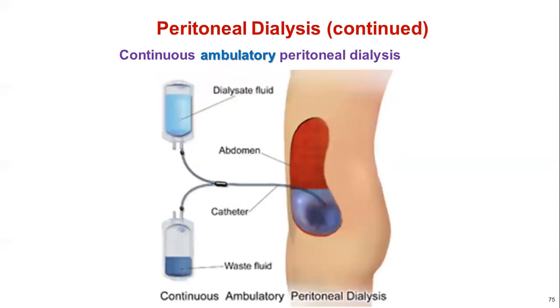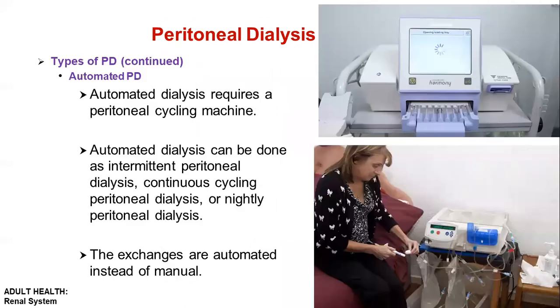So in this picture, I already explained, and here showing a portable peritoneal dialysis. Portable it is, and sometimes patients use it during sleeping time. The name of this is automated dialysis, and it requires a peritoneal cycling machine.